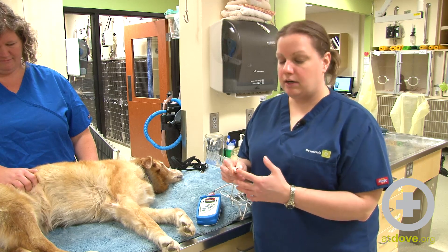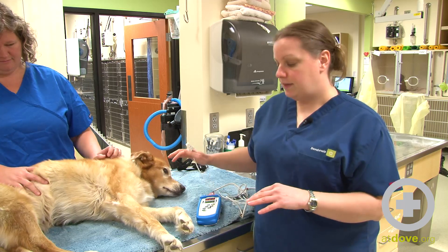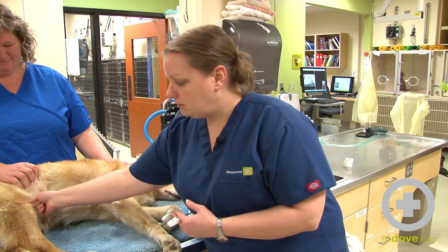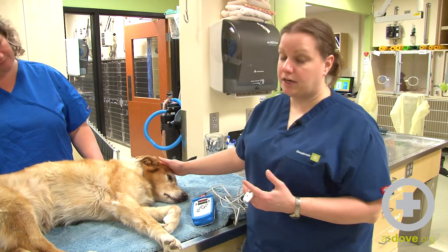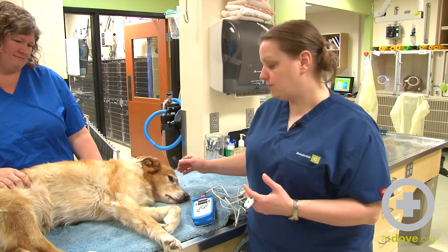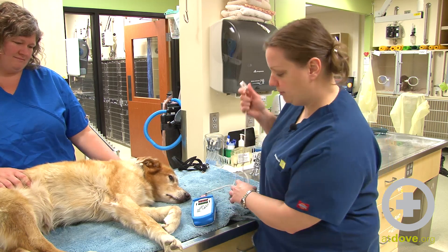You want this to go on an area of very thin skin, so usually the lip, the ear, the toes, sometimes in the inguinal region where you kind of pinch some skin on the flank. On male dogs you can use the prepuce. On female dogs you can use the vulva as well. All of these places where you're trying to find some mucous membrane or very thin skin where you can place this probe.